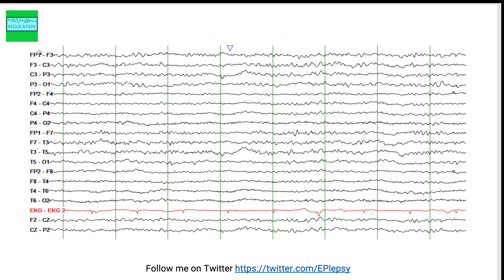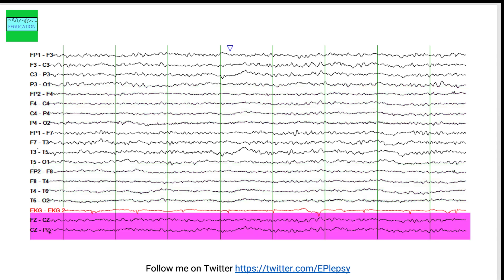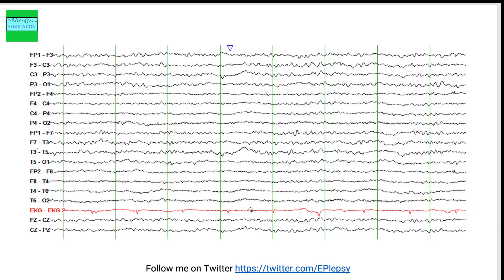All the channels that end with an odd number are recording from the left side of the brain. Channels that end with an even number are recording from the right side of the brain. Channels that end with the letter Z are recording from the midline. The red line here is the ECG, recording the ECG rhythm. The green lines are separated by one second.